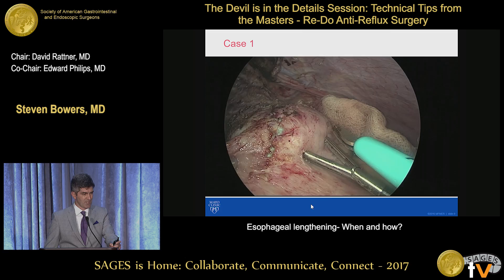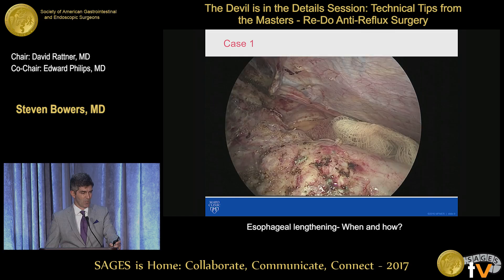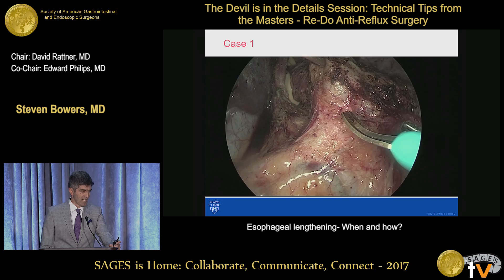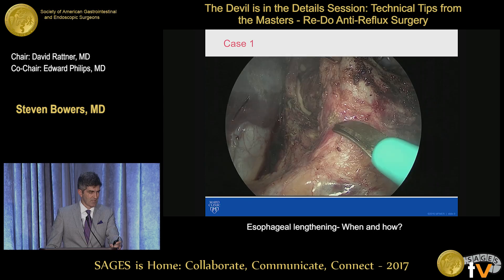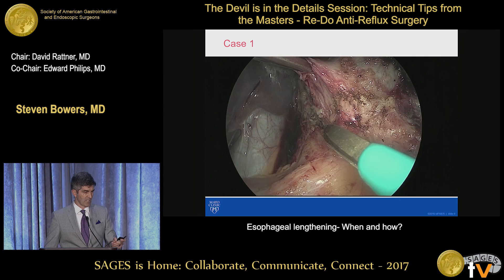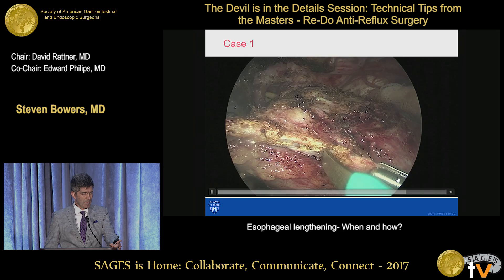And you can see where the wrap is now — it's really quite scarred. You can see some Ethibond that will kind of lead you to where the wrap is. I don't really like to attack it anteriorly in this multi-redo setting. I like to go down to the base of the patient's right aspect of the fundoplication. I can usually find a plane in there, and then that usually helps me get into that plane underneath the fundus. So you can see this plane kind of starting to develop, and then we'll take our fundoplication completely down, and then we'll do our esophageal length assessment.